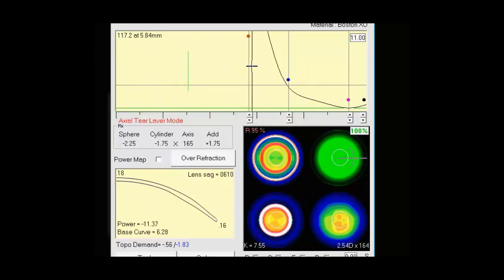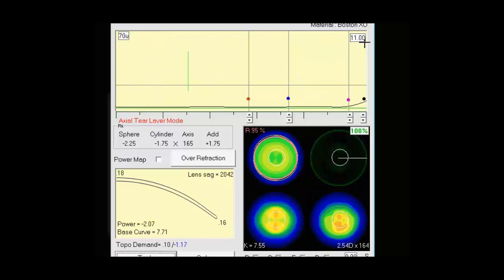All the way across in the upper right, we have our lens diameter. It's currently set to 11.0. If you want to change lens diameter, this is a dropdown. You see we can design lenses as large as 18 millimeters and as small as 8.6 millimeters.